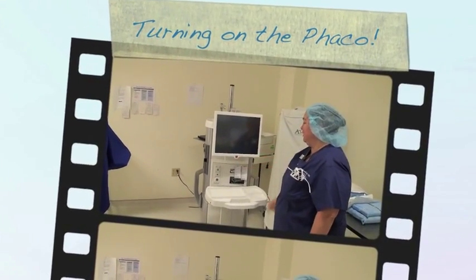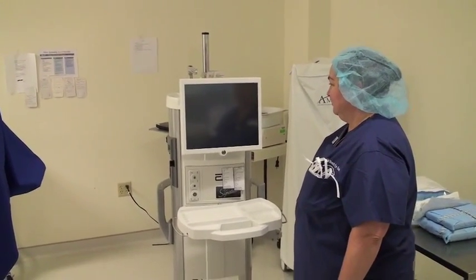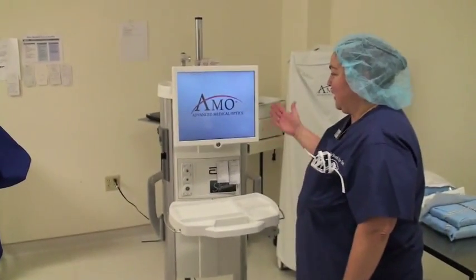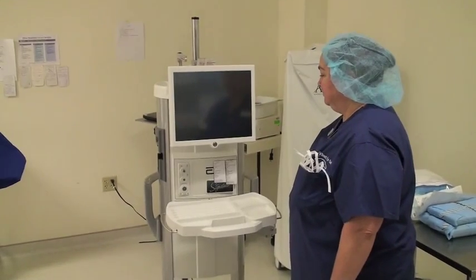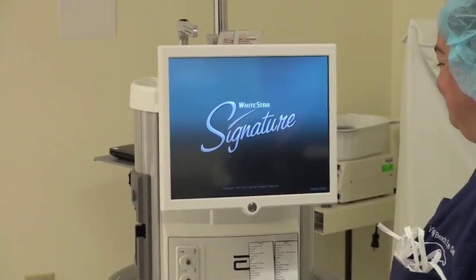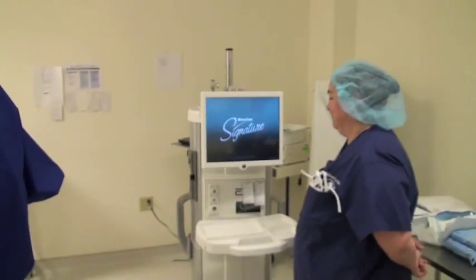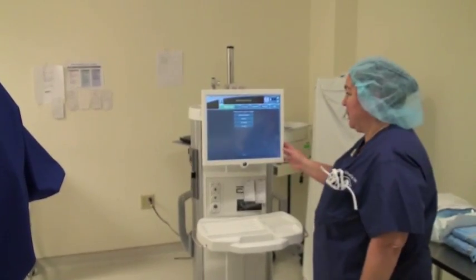You're just going to press this little button here, and then the phaco machine will run through its little self-test. It's going through its self-check, so it does tell you it's ready.